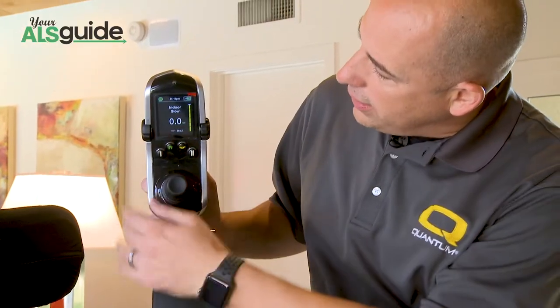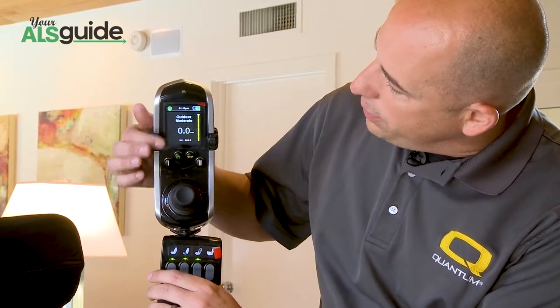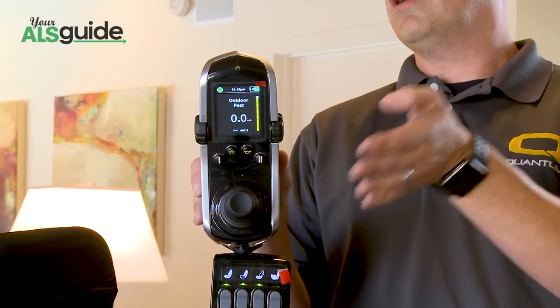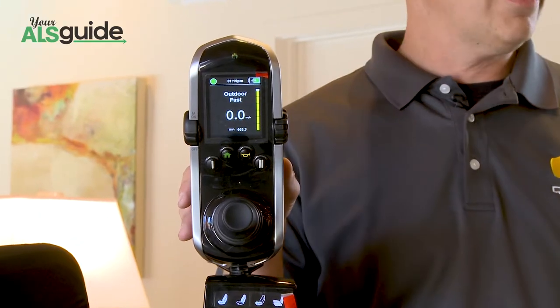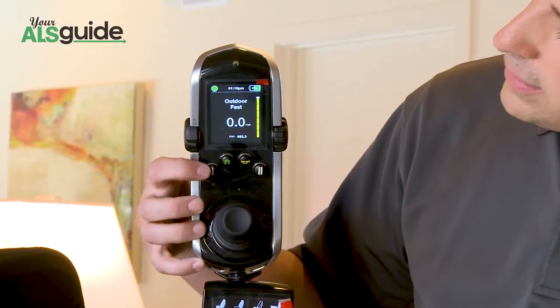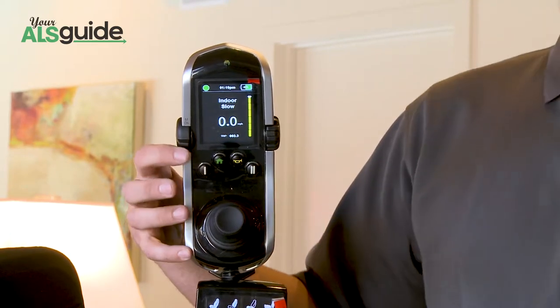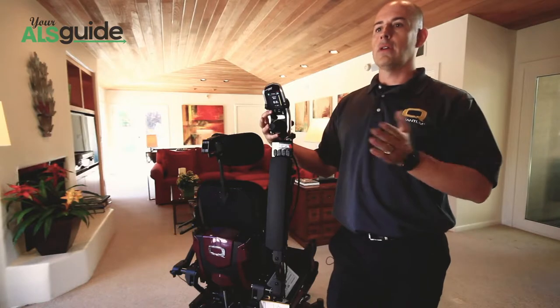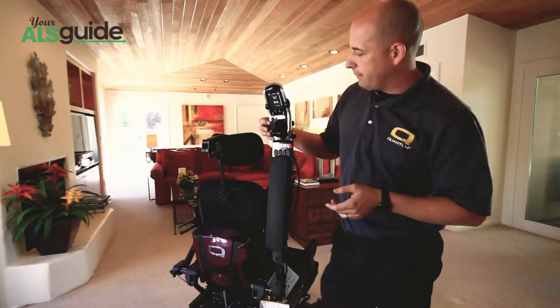One of the great shortcuts that I like, you could be all the way up in your outdoor fast, cruising along, and then you come up to a doorway or a tight environment or in a store where there's lots of people. You can very quickly press this number one key here, and it takes you to your slow profile and allows you to maneuver nimbly through a tight spot.